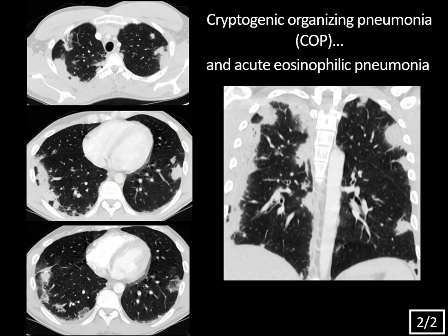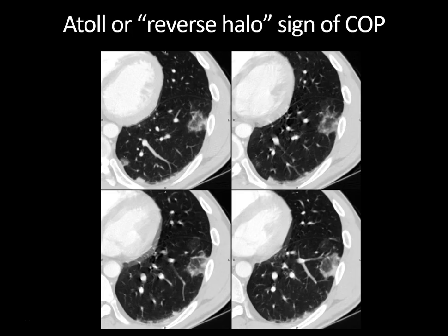Looking further at the reverse halo sign — central ground glass opacity surrounded by a rind of increased airspace density — this is actually fairly specific for COP, though only seen in about 20% of cases. It's also been described in opportunistic infections and sarcoidosis. Don't confuse it with the halo sign, which is the opposite: a central solid nodule surrounded by ground glass opacity, seen in angioinvasive fungal infection and other diseases. The other name for the reverse halo is the atoll sign — an atoll being a ring-shaped reef or island formed of coral. One wonders if the radiologist who coined that term was thinking of a more tropical environment than the dark reading room they were trapped in.